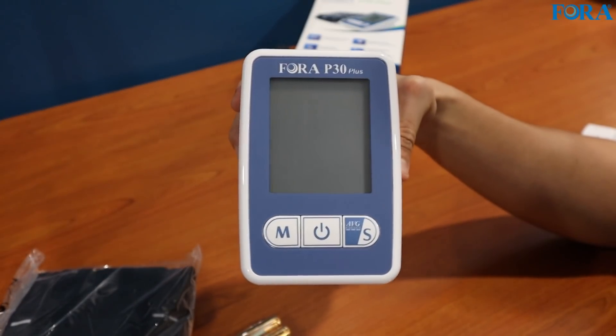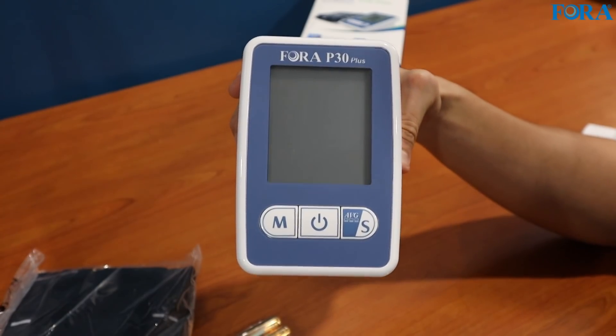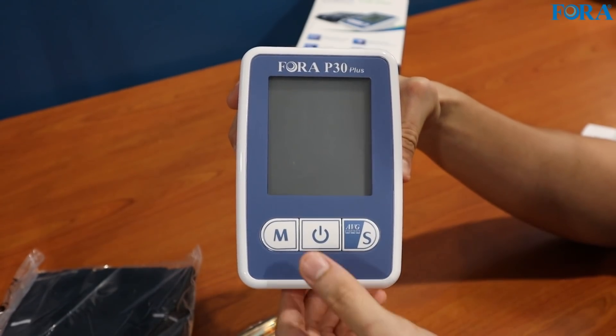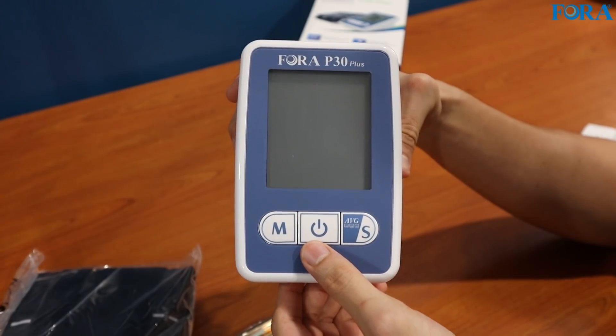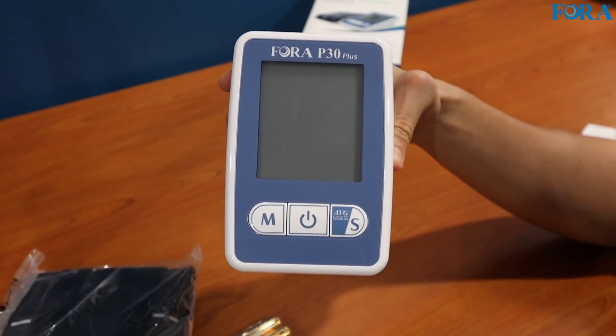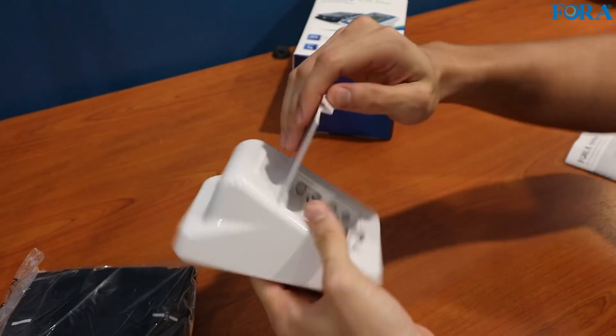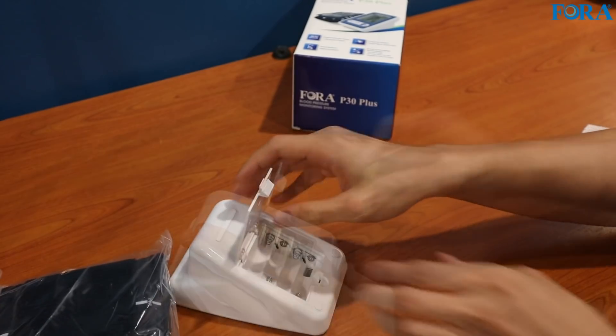Here's a closer look at the main unit. On the left you have the memory button — this is where you go if you want to look back at your previous readings. Here's the on/off button, which is also the start button. And on the right you have the average function, which takes the three readings for you. That's pretty much it. Let's put the batteries in — it's a very simple design, nothing too complicated.